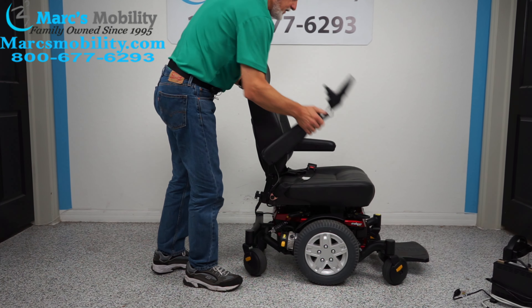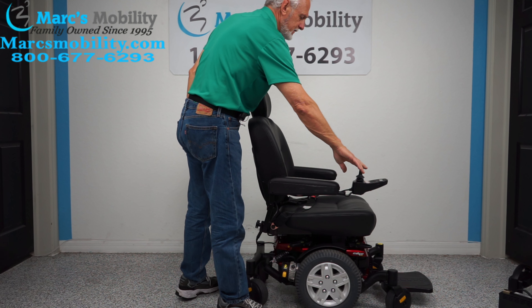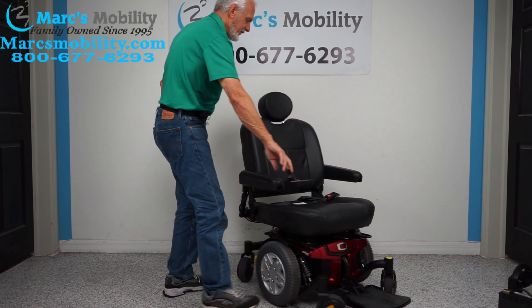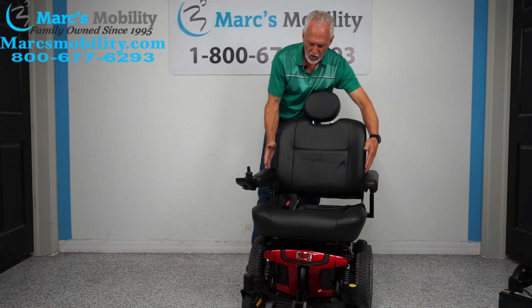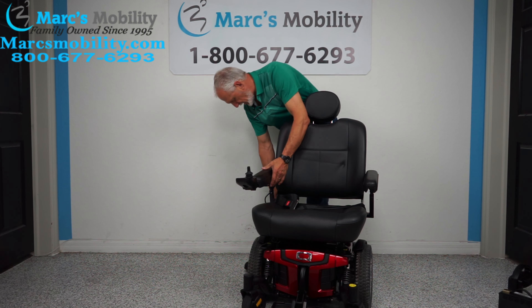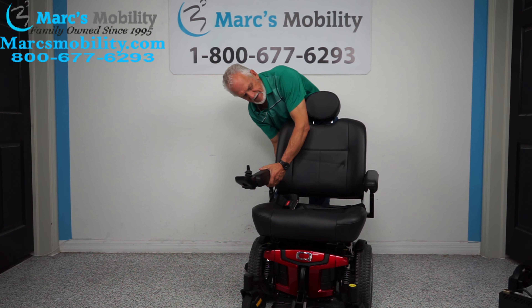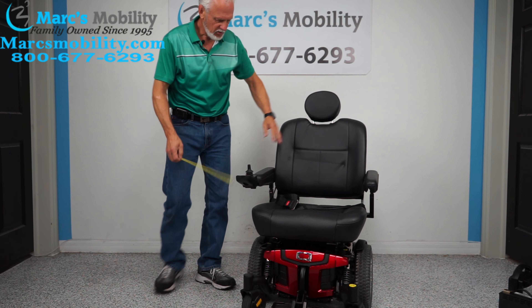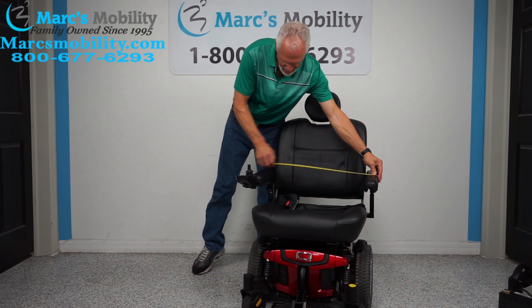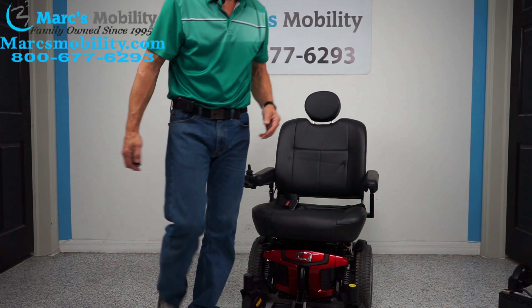These are flip-up arms, so both arms can flip up. Let's turn the power back on. You have a safety belt right here. These arms can go out also, so if you need more width and you want these arms to go out, it's not hard. So they can be moved out. Right now, the way the chair is with the arms as far in as they can be, the total width of this chair — the arms are usually a little bit bigger than the wheels — is about 27.5, let's say 28 inches. That's your magic number.